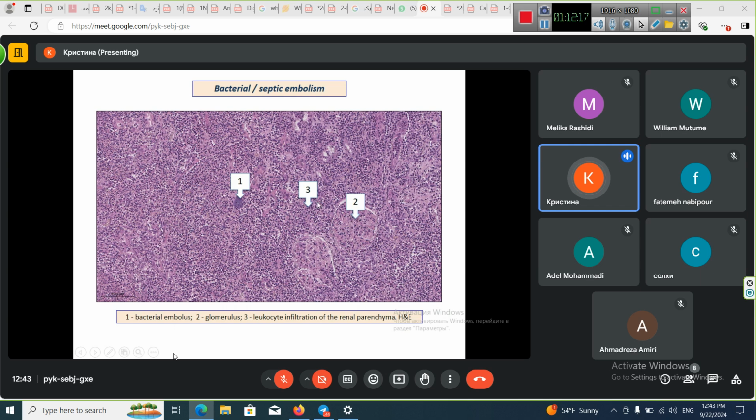It means that here we have incoming cells. They are cells, leukocytes, which came here to fight infections. Because here we see bacteria, so the bacteria will not be only inside blood vessels, they will finally go outside, and it causes the leukocytes to come here in this area to try to fight the infection.